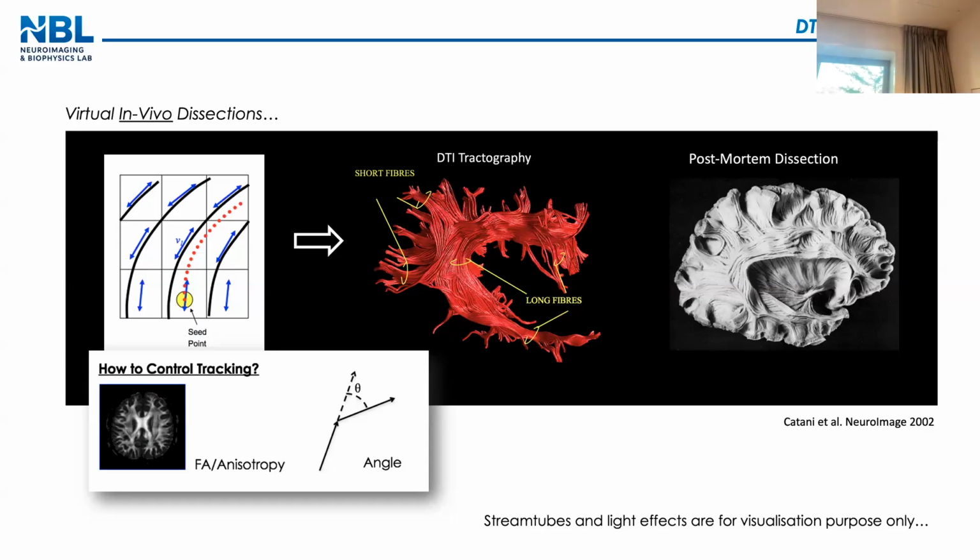But what is also important to realize is that the individual streamline here is not a biological entity. It's not a real axon. It's not a real fiber. Remember, it's a mathematical construction of the whole field of tensors. So the individual streamline starting here, stopping there, might not be real. What is probably real is the overall shape. We have something starting from here, going here, some kind of a structure of U shape on the back.